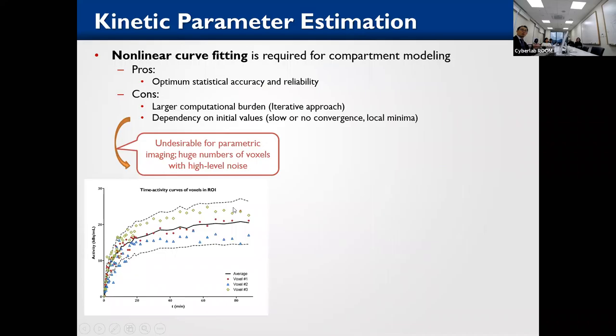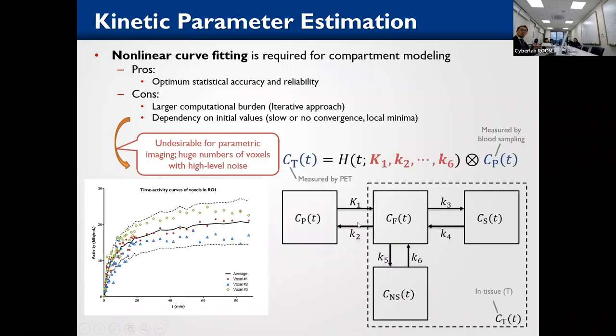So at first we guess K1, K2, K3, K4. Any value can be tried, not just zero. If we have a plasma concentration curve and we guess these values, then we can mathematically generate some curve. It looks like maybe this curve. Then we compare the measured one and the generated one. If they are very different, we can adjust these parameters somehow.